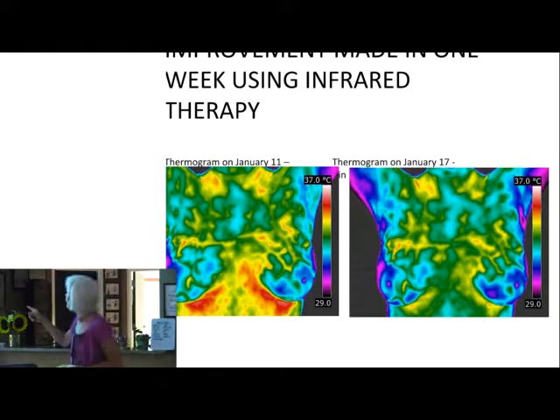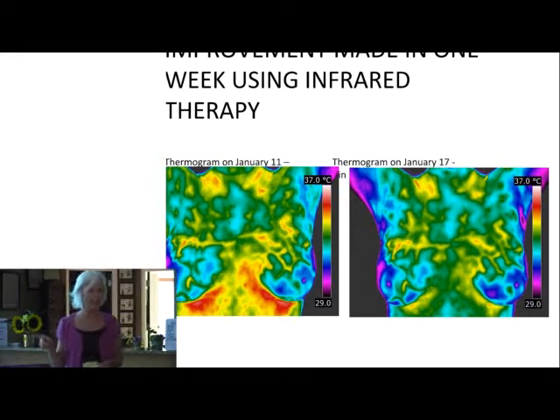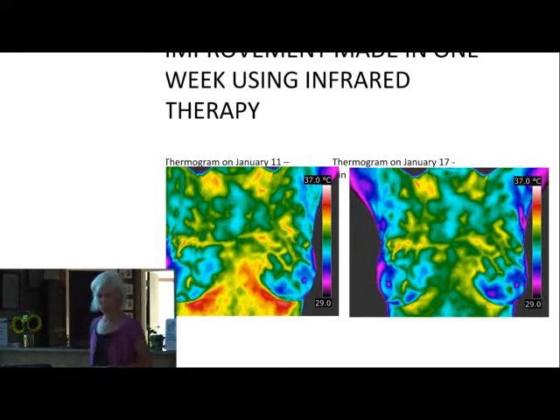This lady is an airline pilot, a female, and by the very nature of what she does, she's at high risk. Flying an airplane with the controls, the radiation from being high, crossing the country all the time, she's at risk. And I asked her if she would help me experiment with the camera by using infrared therapy.